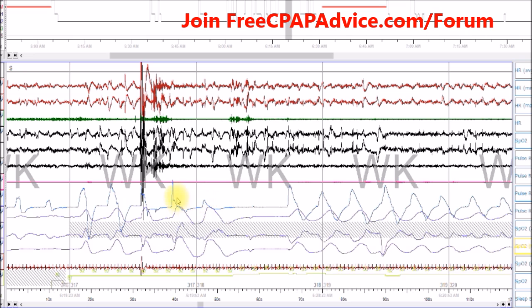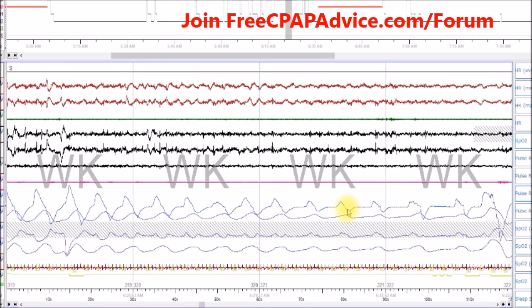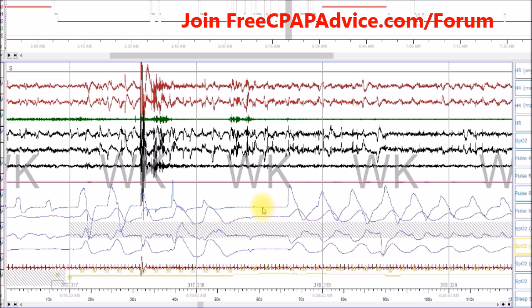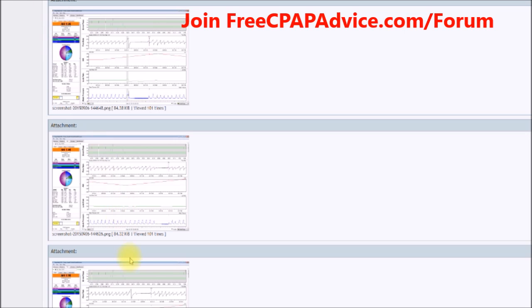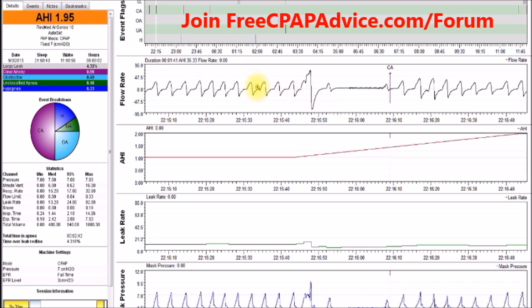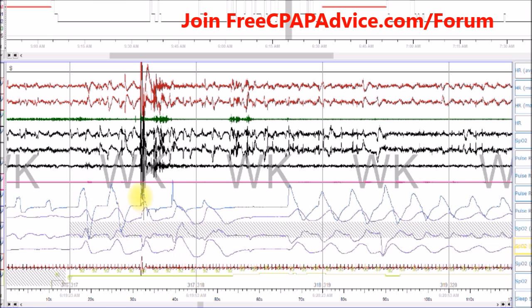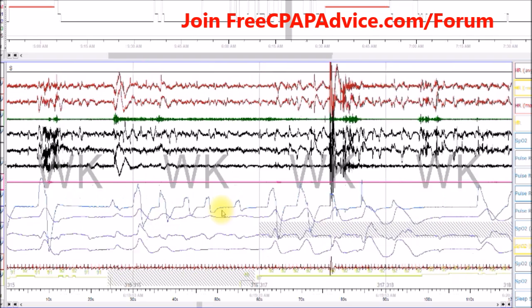You can see how right in here I would call this not normal breathing, because we've seen what normal breathing looks like. A lot of times you'll get these central apneas - or what look like central apneas - on your SleepyHead report. Sometimes people post their SleepyHead report and it's very jagged like this; you can tell they're awake and moving around. When you're awake and concentrating, you just happen to stop breathing - that's kind of what you're seeing there.